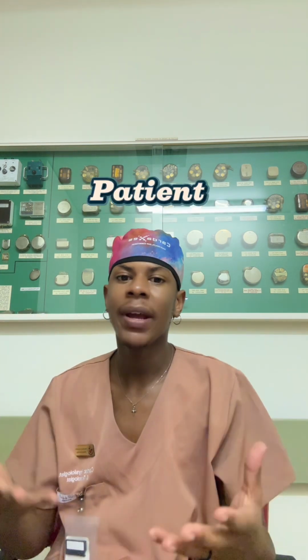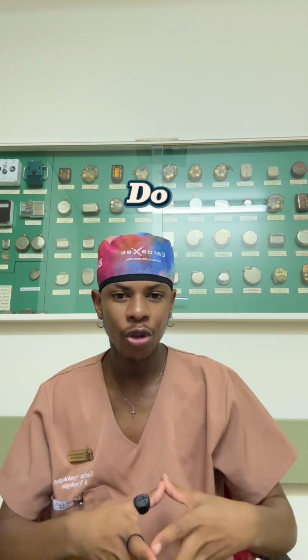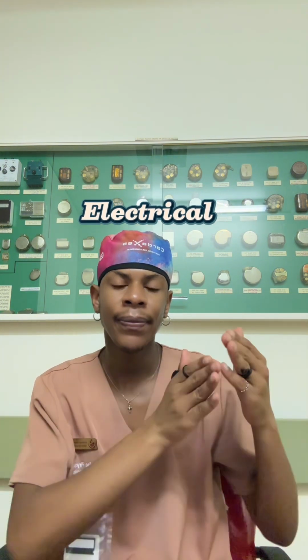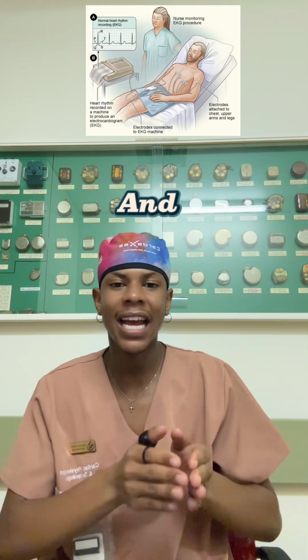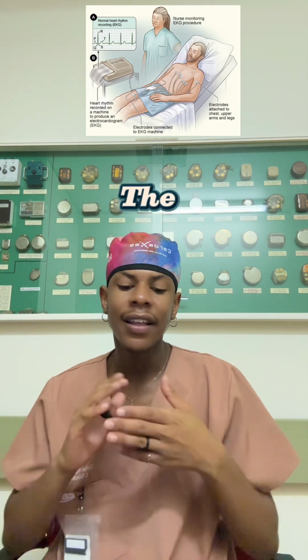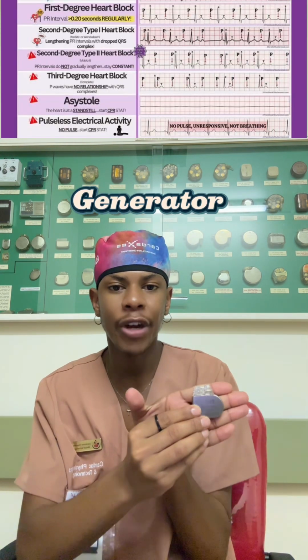When a patient experiences the symptoms that I've mentioned, we usually do an ECG, which is your electrocardiogram, which gives you a summary of the heart's electrical activity. We then analyze the ECG, and after we have successfully analyzed it and identified the conduction issue, we then implant the pacemaker. The pacemaker consists of the pulse generator.